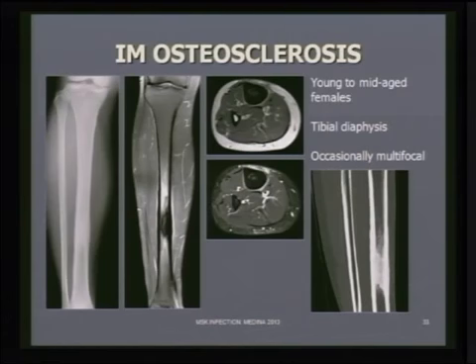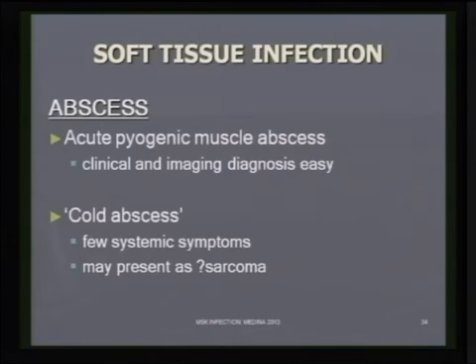But it's a condition now we clearly recognize, and the obliteration of the medullary cavity is very, very nicely demonstrated on CTs. But this is a diagnosis now we recognize on imaging, and it's managed basically purely symptomatically.